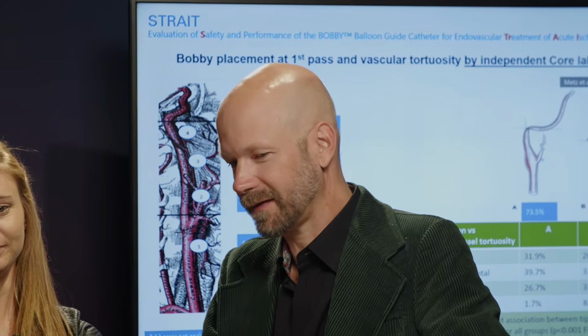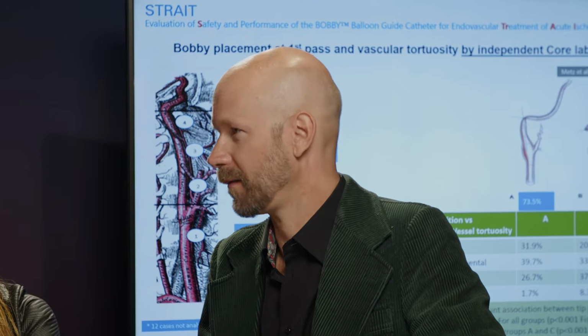So it's good to see that you recorded the position of the balloon guide in this trial, because I think that's one of the main things, the most important factor for the success. Yeah, we planned that from the beginning because you also have to have the images where you can see this. So yes, this was one important endpoint for the study, and of course it is dependent on the anatomy, obviously.